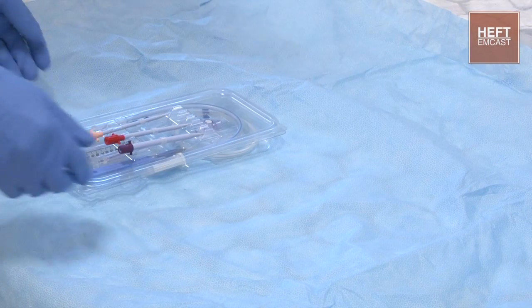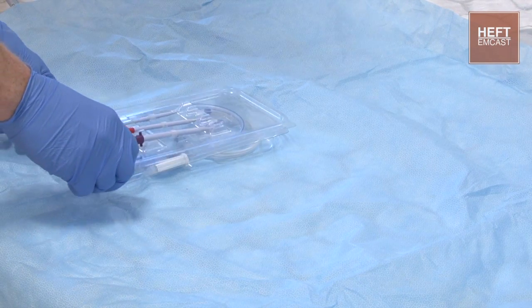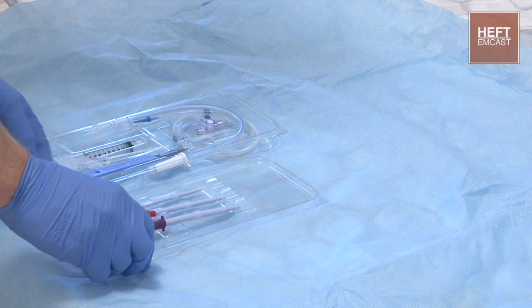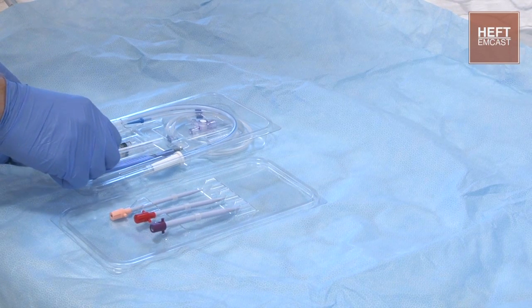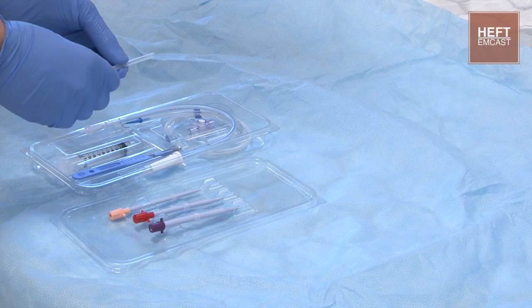So that's going to be the kit that we're going to be presented with when we're looking at Seldinger chest drain. If we just open it and go through each bit in turn, it's wise to check through your kit before you do any procedure, just to make sure you're familiar with everything.